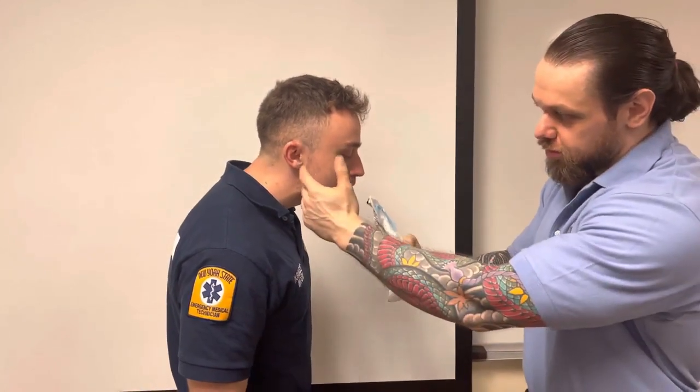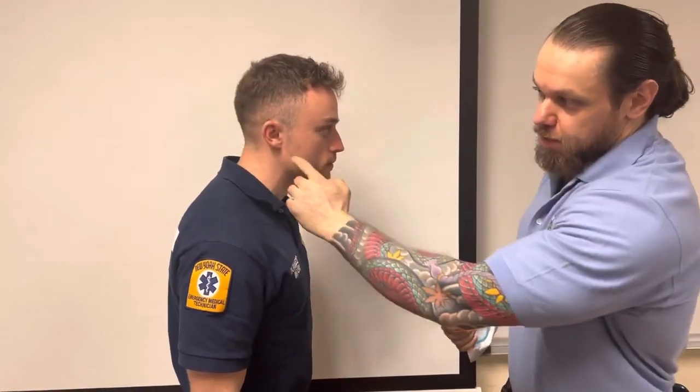So ear to the sternal notch, and the way we do it, we do padding, right? If we did this for him and he has a cervical spine injury, we now potentially cause damage or harm to him. If he had like a C3, C4 injury, we don't want to have him be paralyzed, or impair his phrenic nerve and then the diaphragm, the respiratory functions, right?